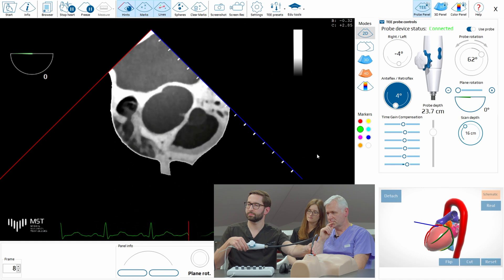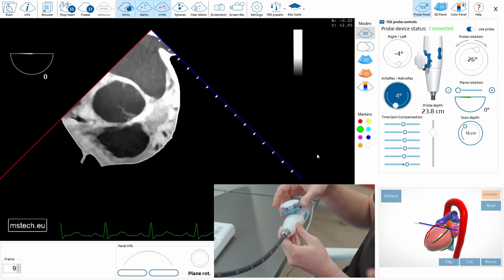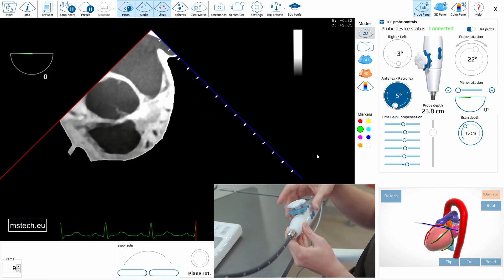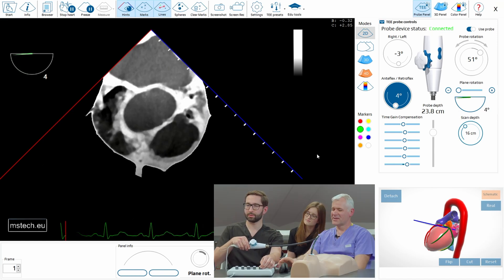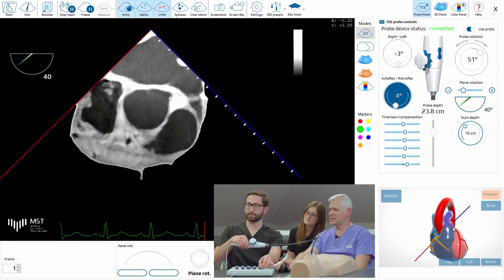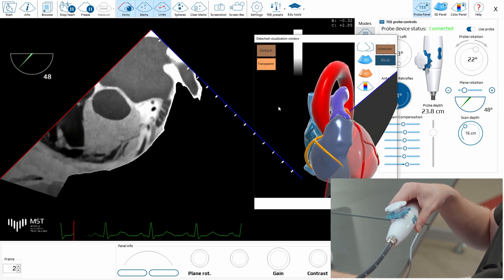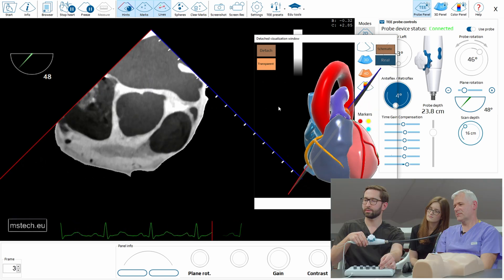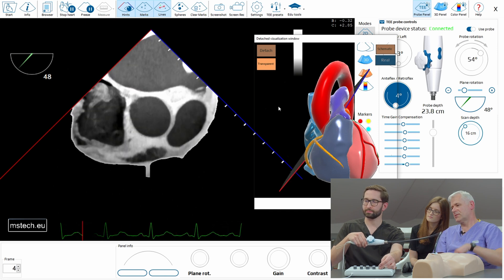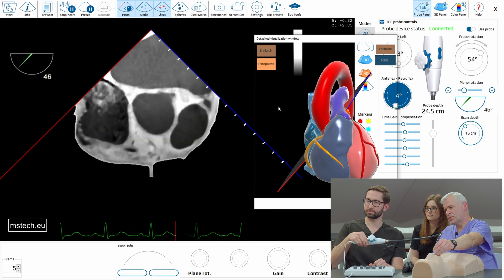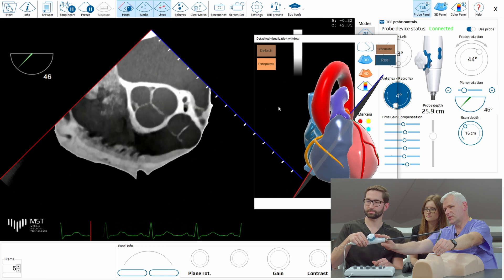Descending. What to do to see really the circle instead of an ellipse? We have to change the rotation a little bit. I will just make it visible here — to make it a circle as we discussed. We should keep in mind that we have to have the circle of the ascending aorta, not elliptic. And now slightly push the probe, try to keep it always in the center — it really pays when you have it.